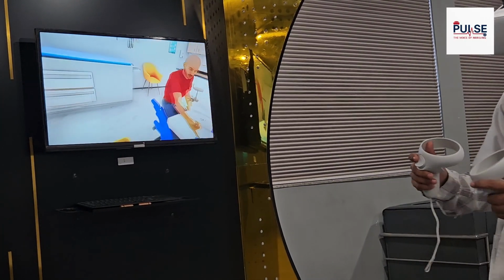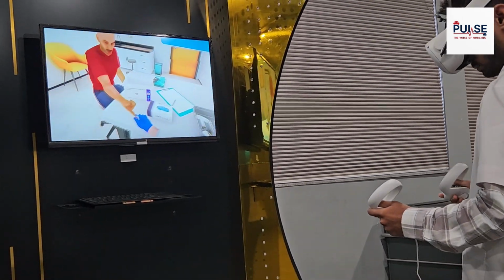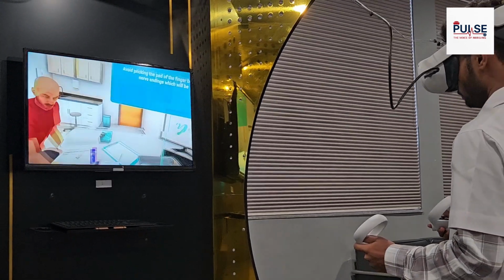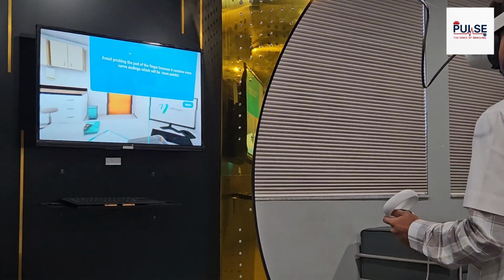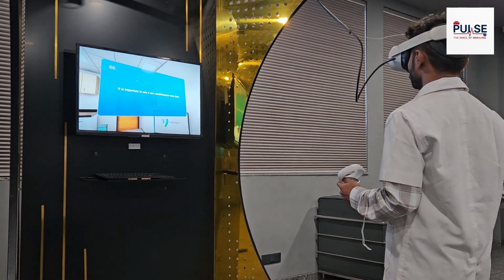Now we are going to learn about the lancet. Tap on the N button to get started. Avoid pricking the pad of the finger because it contains more nerve endings which will be more painful. It is important to use a new needle or lancet every time.